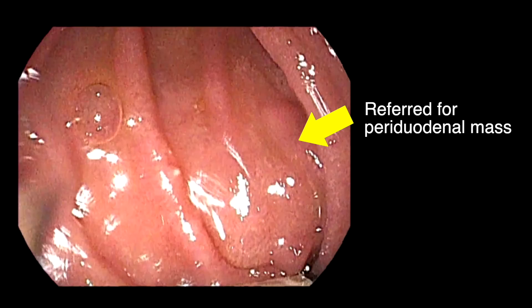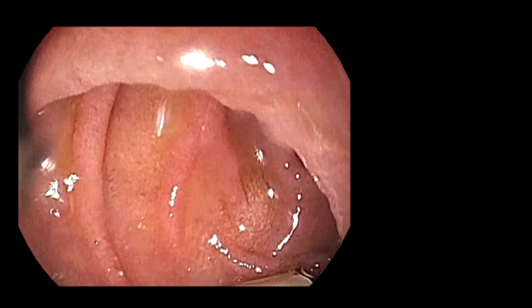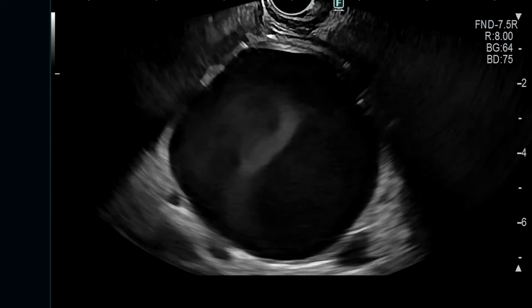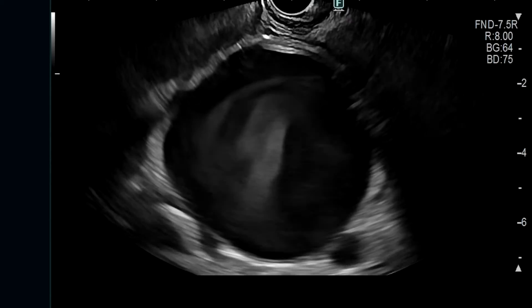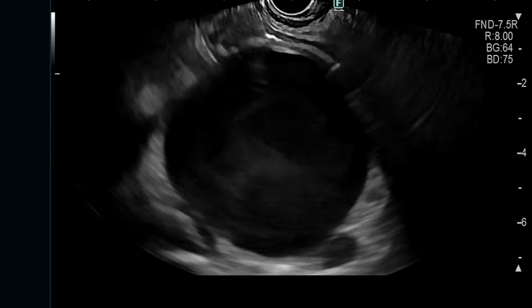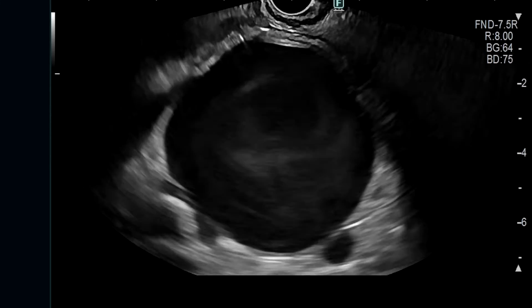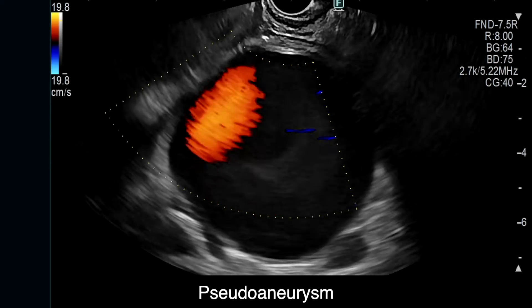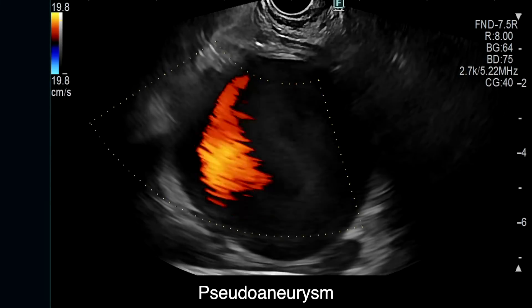This 56-year-old patient was referred for evaluation of a periduodenal mass. On EUS examination, the lesion was found to be a vascular lesion with flow consistent with an aortic pseudoaneurysm.